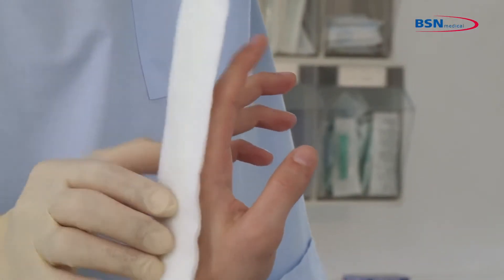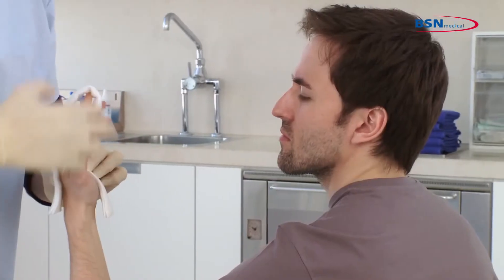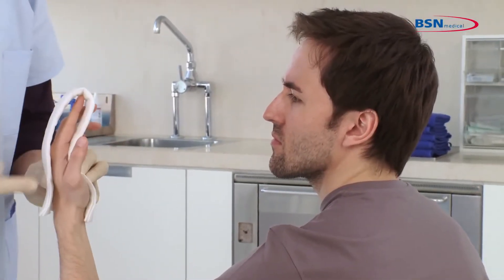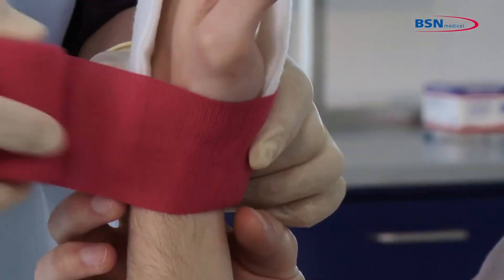Slide the splint on the finger and make sure both ends conclude at the wrist joint. After this, anchor the bandage at the wrist joint.